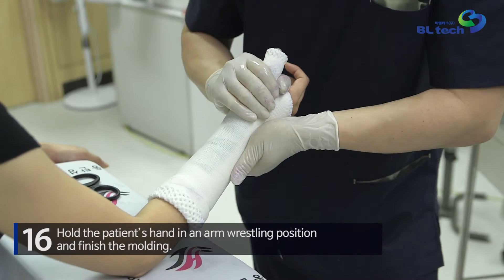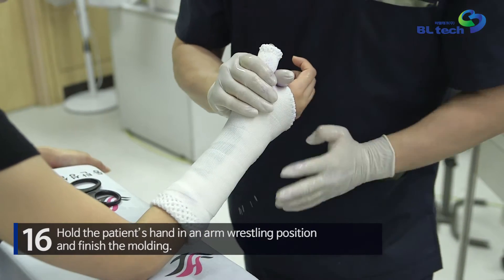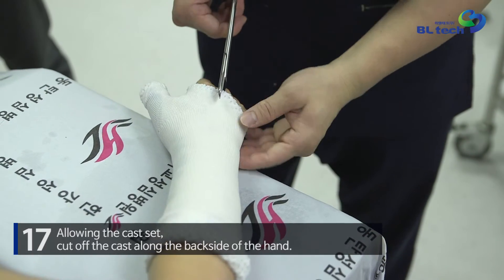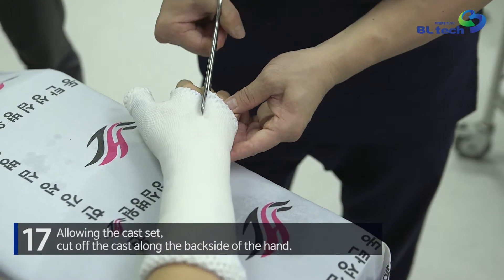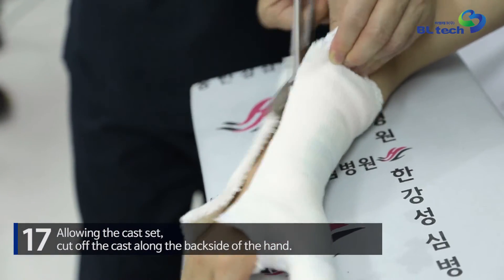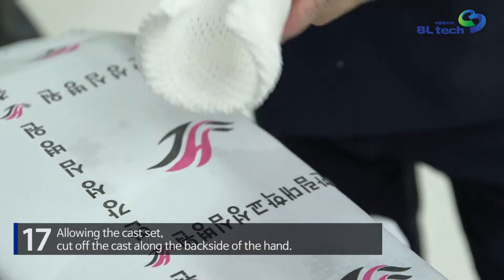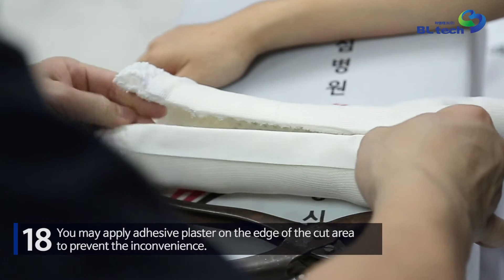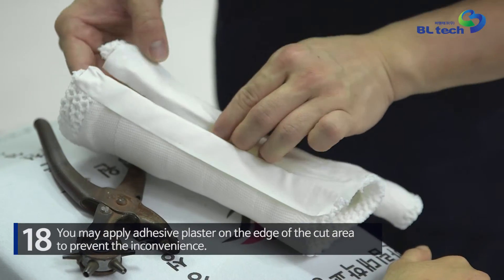Hold the patient's hand in an arm wrestling position and finish the molding. Allow the cast to set, then cut off the cast along the back side of the hand. You may apply adhesive plaster on the edge of the cut area to prevent inconvenience.